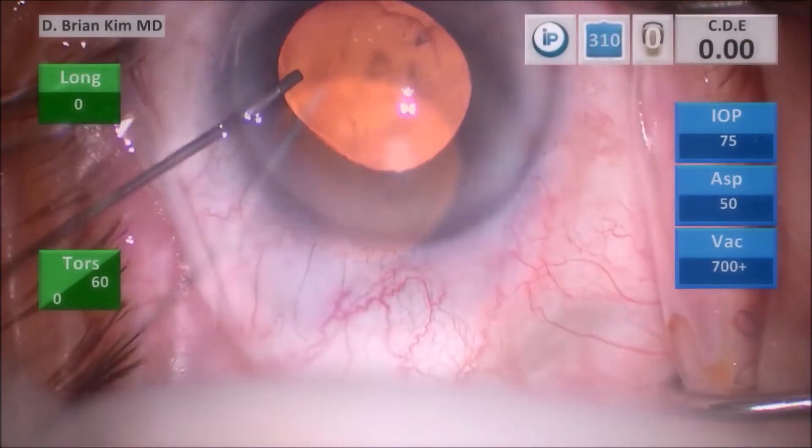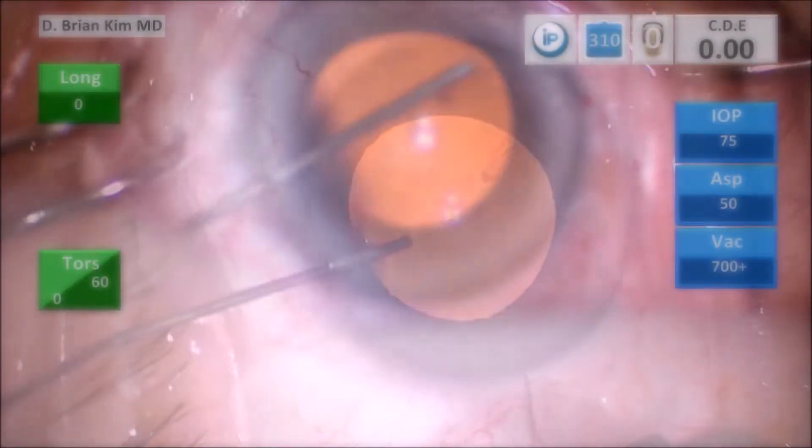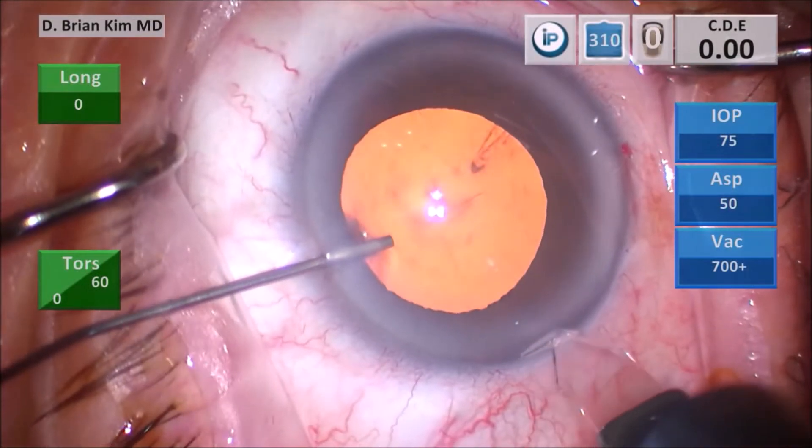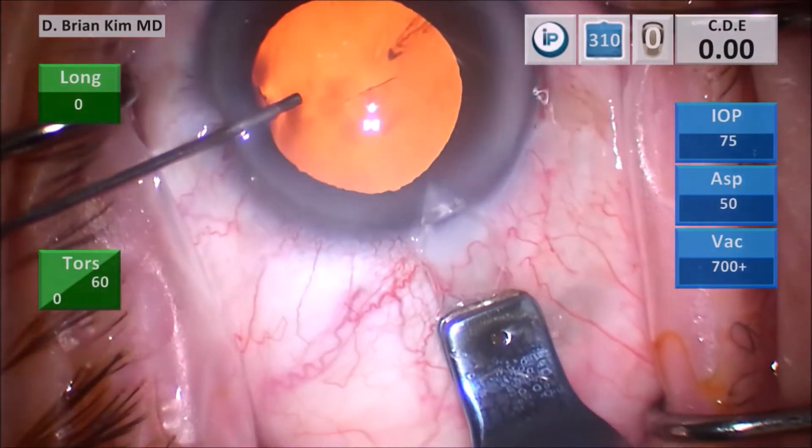I'm injecting dispersive viscoelastic, and then I do my triplanar corneal incision. I make a vertical groove, then place the blade through the groove tunnel and enter the anterior chamber for my triplanar corneal incision.